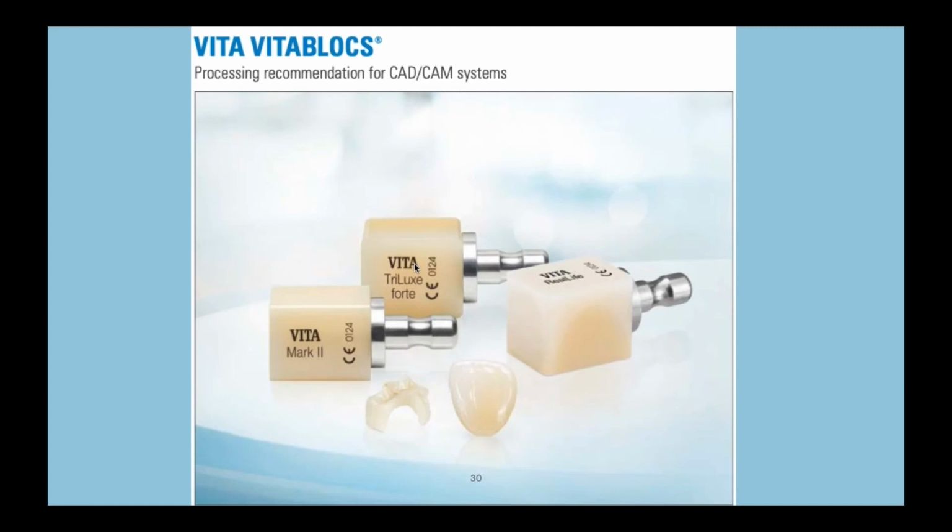Remember, if you have good tooth structure left, you don't need a lot of reduction, because the labs are always saying, I need more room, I need more room. And what happens when you ask the doctor that, he's digging away into the enamel, and you're asking the porcelain to do everything if you take too much enamel off. If you leave some enamel and you put these veneers on it, they disappear, because the tooth is the one that's handling the light. It's doing most of the work. And so I don't like a lot of reduction on veneers. Just have to be careful when you do them.